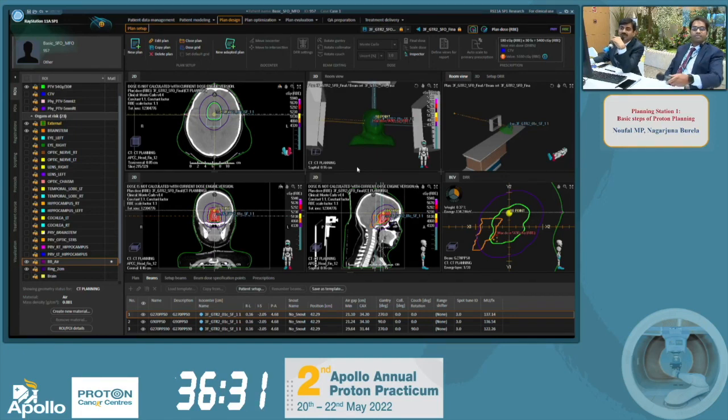Yeah, it's a good question. Sometimes it's very difficult to get the material details from clinicians. In that case, if we don't know, most of the time we will try to block the materials. There is a separate technique called blocking. We should not pass any beams through that. Mostly we will be avoiding beam entry through that material, wherever possible.